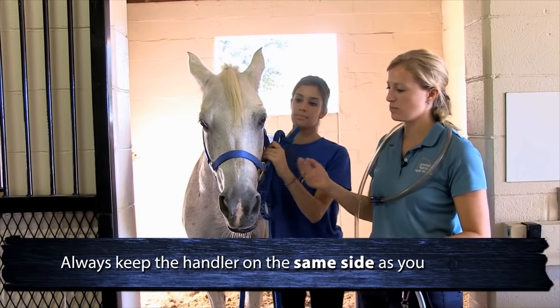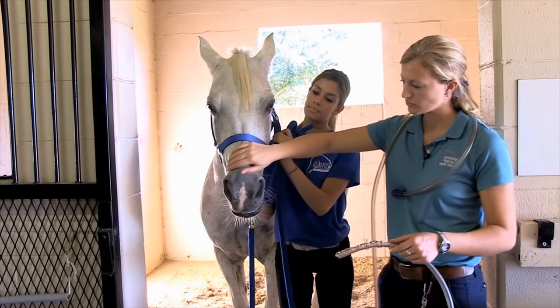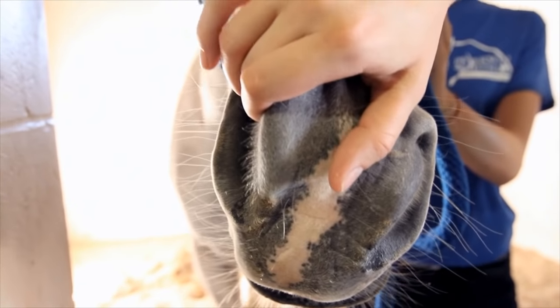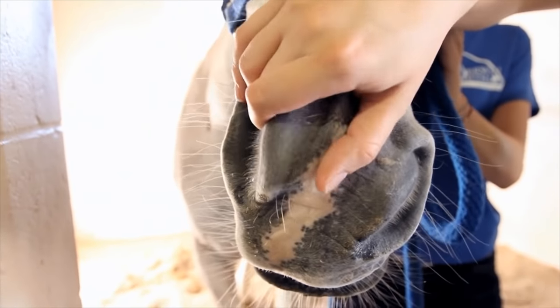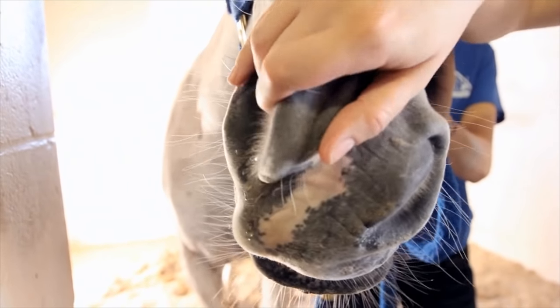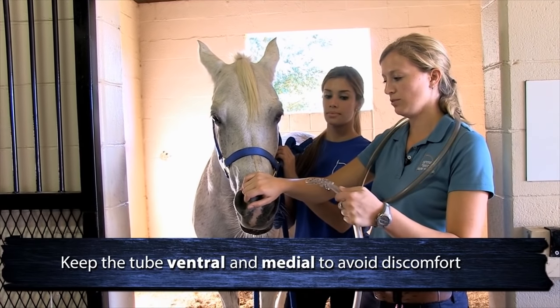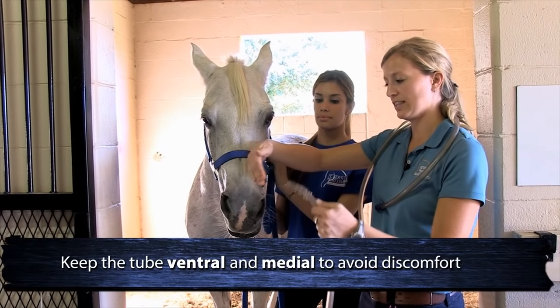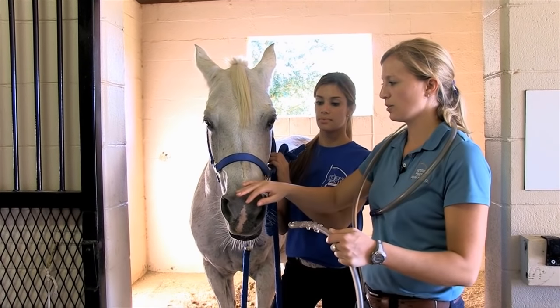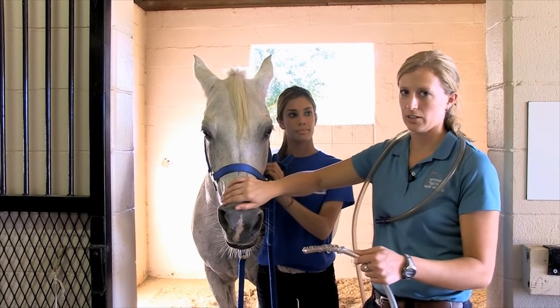I have my handler on the same side. I'll grab her nostril and rub the inside of her nose, just letting her know I'm here. When passing the tube it's important to keep in mind that you want the tube to be ventral and medial — down to the inside — so you can avoid the ethmoids up here, because if you hit those the horse will often get a nosebleed.